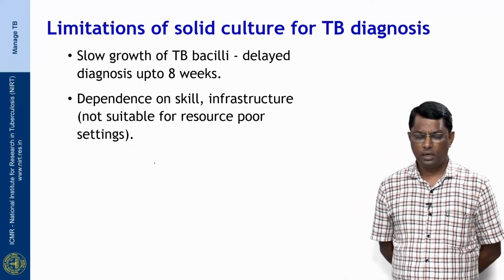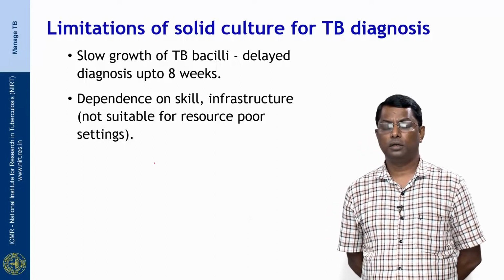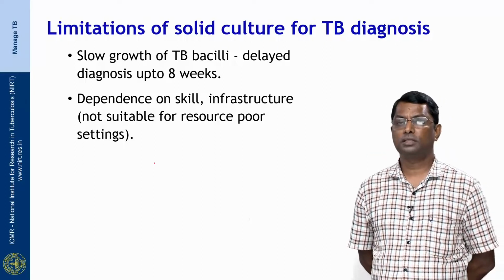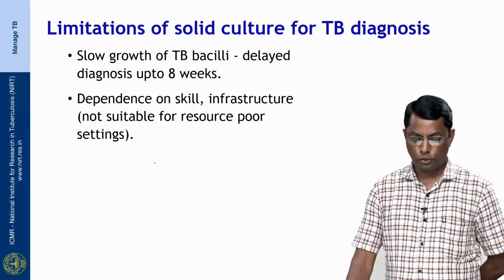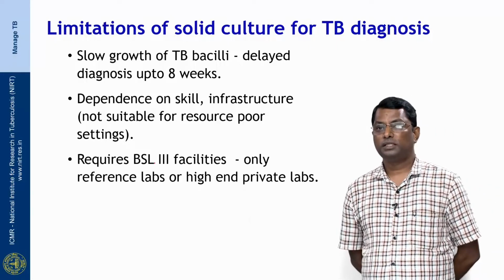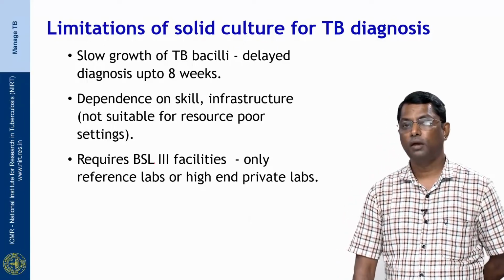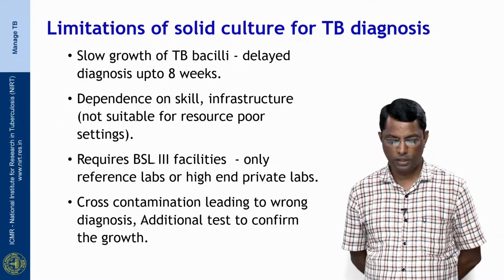It requires a skilled person to prepare the medium, to have a sample processed and inoculated, and requires infrastructure for handling this culture and processing of the culture. So, it is not suitable for resource poor settings. It requires a BSL-3 facility, so only reference laboratories and high-end private laboratories can perform solid culture using Lowenstein Jensen medium.